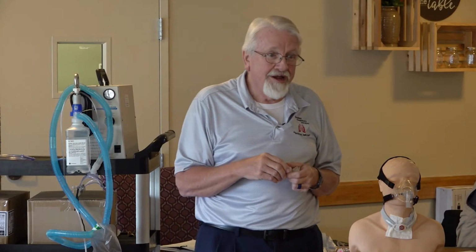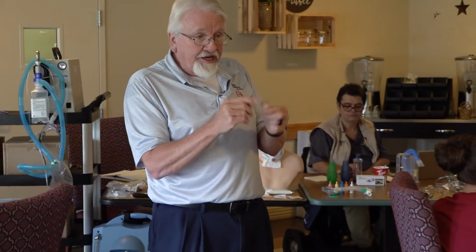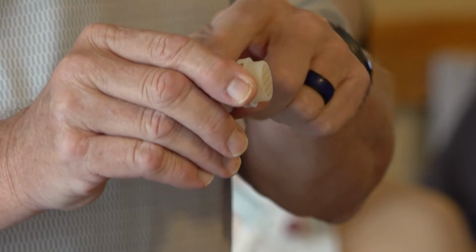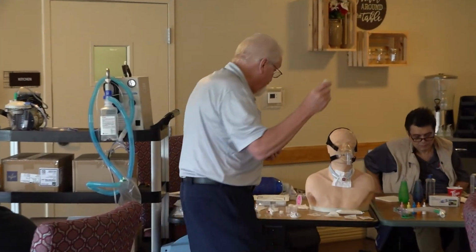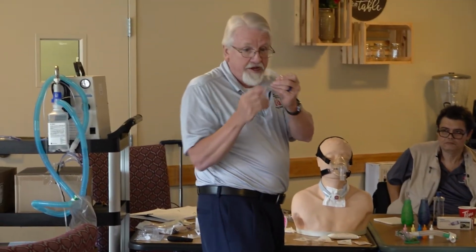Just because. Do you change those out? It depends on the patient, but typically the patient's going to know, because the foam has become absorbent, and that is causing resistance in their breathing. So it's kind of patient dependent. So that's the HMEs for the Lary tube.